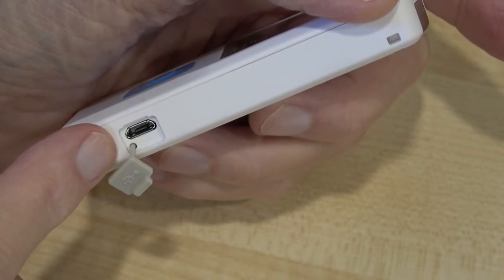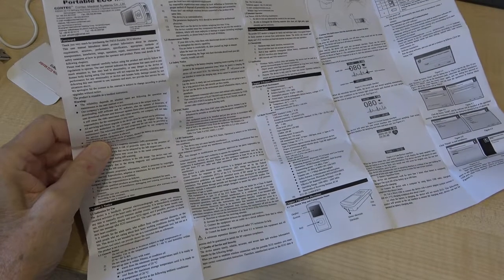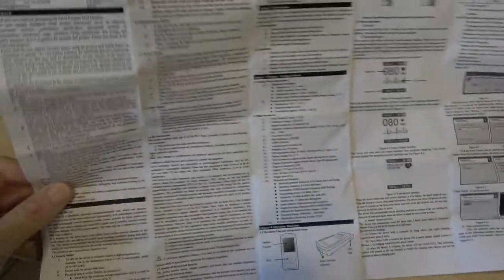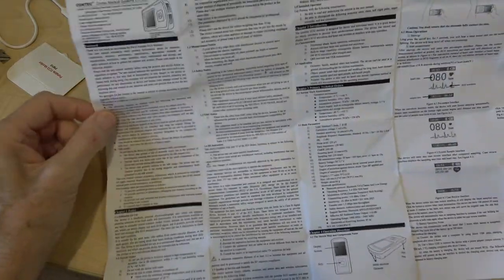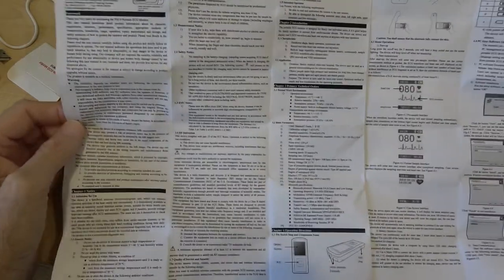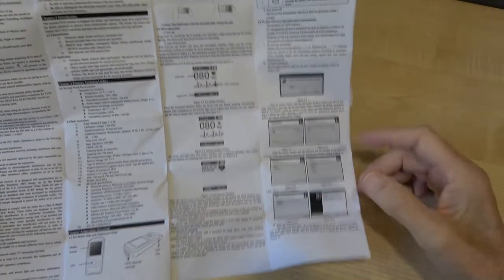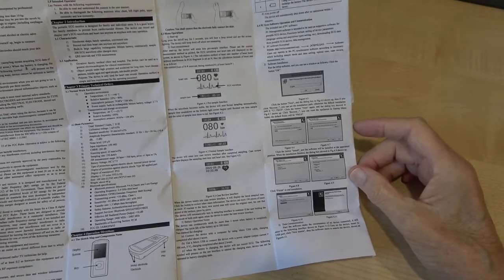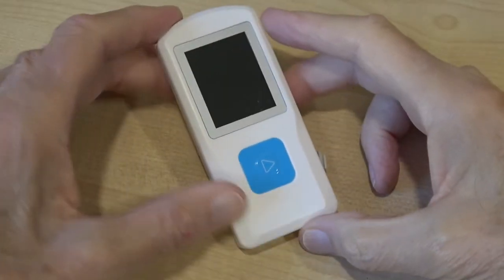There's quite a comprehensive leaflet that comes with it. Most of it is the usual warnings about things you mustn't do with it — about half of it is basically that — but it does have instructions on how to use it and an interpretation of the readings. And even more amazing, it's in English.